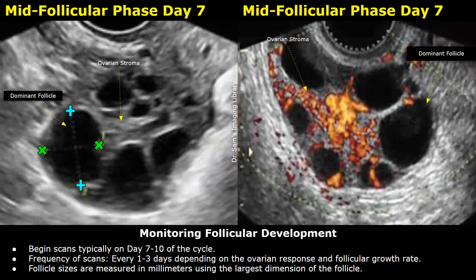Now we move on to day seven of the menstrual cycle. Days one to five are part of the early follicular phase, and days six to ten are part of the mid follicular phase. These images are obtained on day seven, which is a preferred day for follicular monitoring. The frequency of scans is every one to three days, depending on the ovarian response and follicular growth rate.